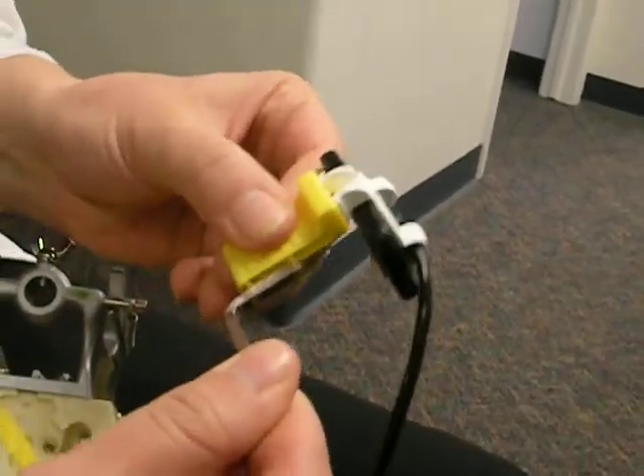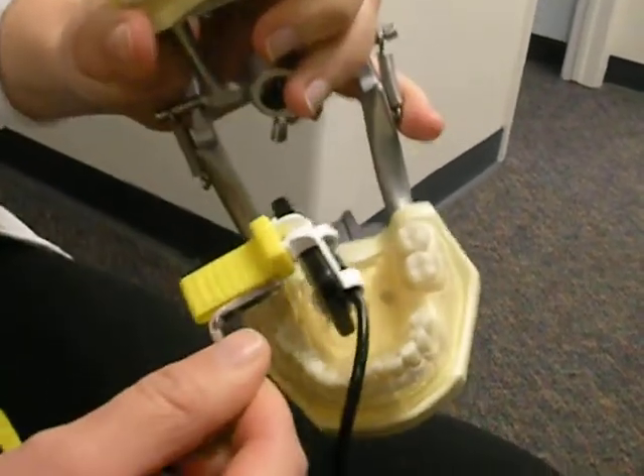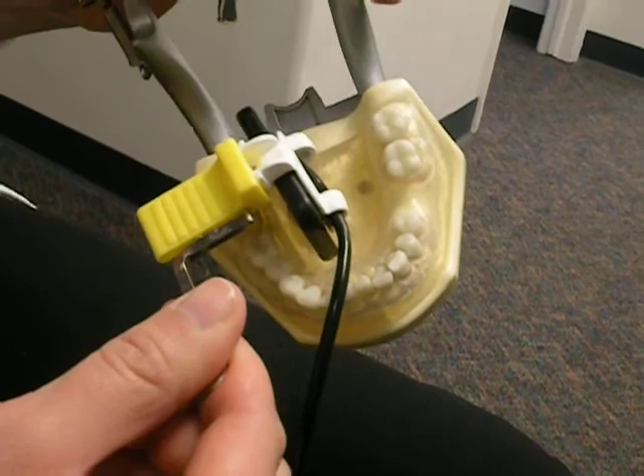You want to close that gap just a little and maybe go a little closer to the tooth. But generally, you want to be as far away as you can for a better shot.